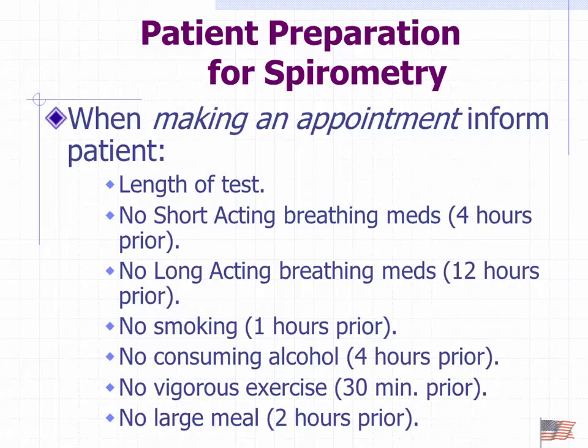12 hours for some long-acting meds. Don't smoke within an hour. It's a shame, but you can't consume alcohol for 4 hours. Because why are we drinking wine at 9 a.m.? Really? No. No vigorous exercise. I'm all about that. Thank you very much. And no large meals. So there's different things we want to tell them to prepare them for doing a pulmonary function study.